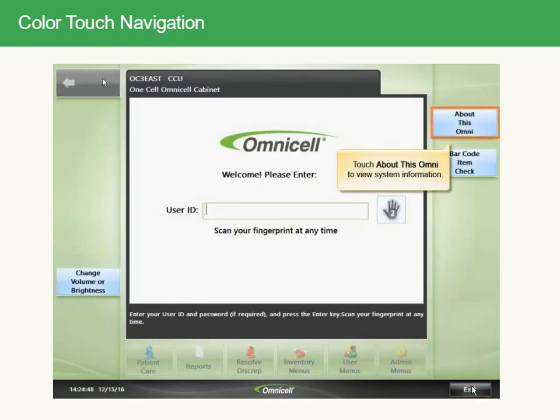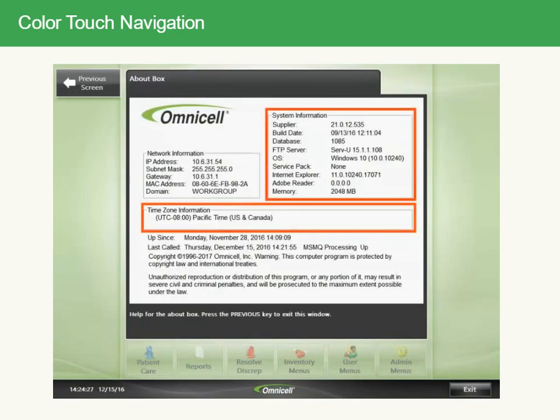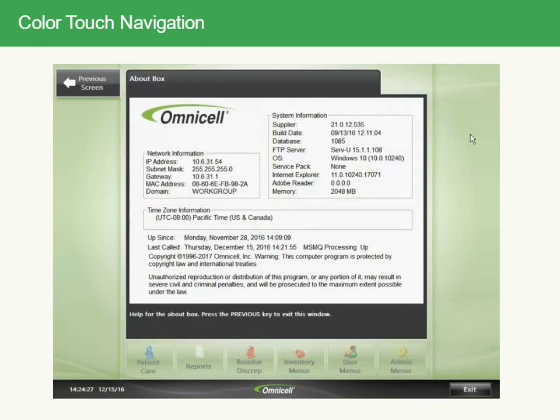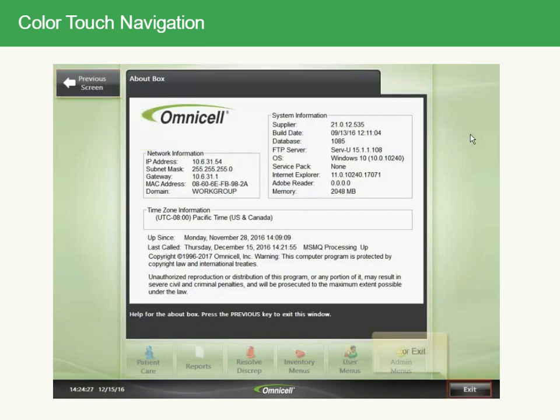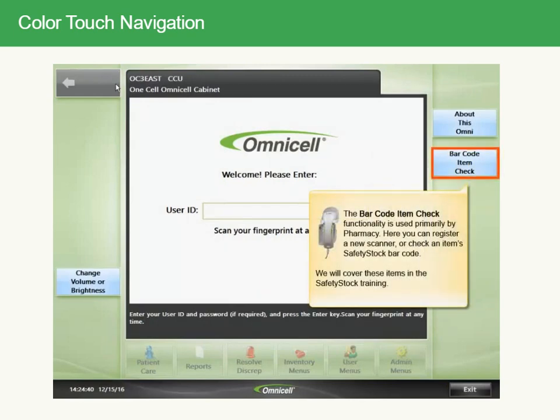Touch About This Omni to view system information, then touch Previous Screen or Exit to return. The barcode item check functionality is used primarily by pharmacy, where you can register a new scanner or check an item's safety stock barcode. These items will be covered in the safety stock training.